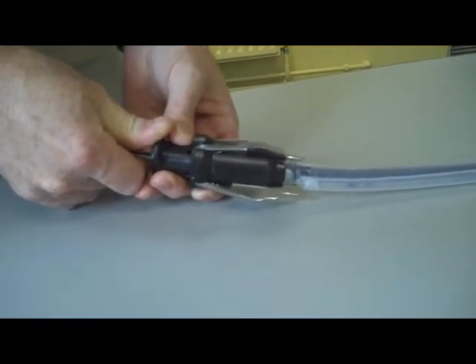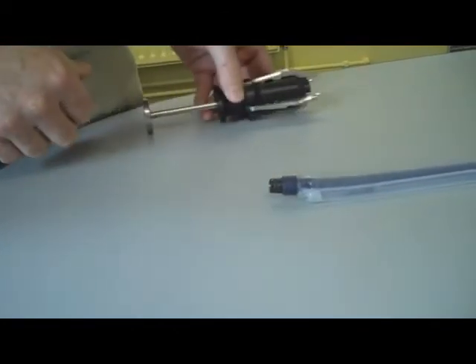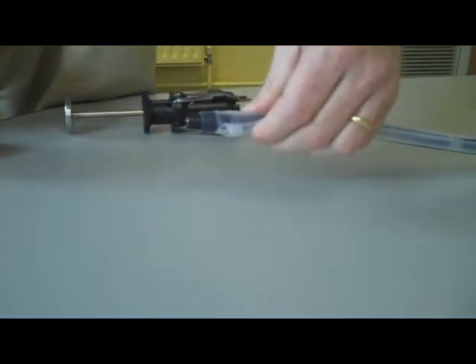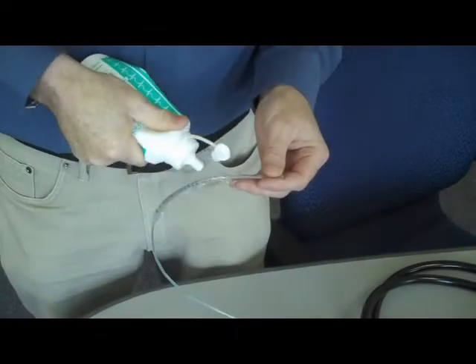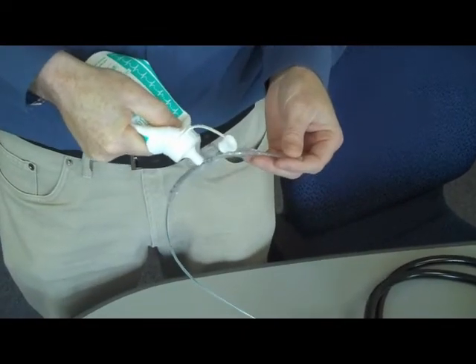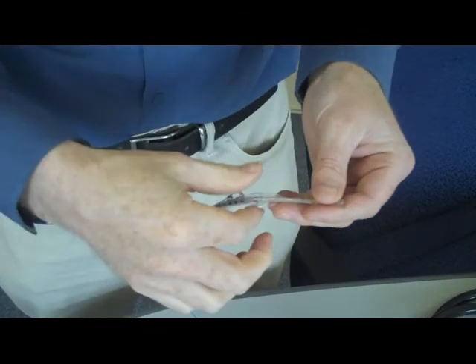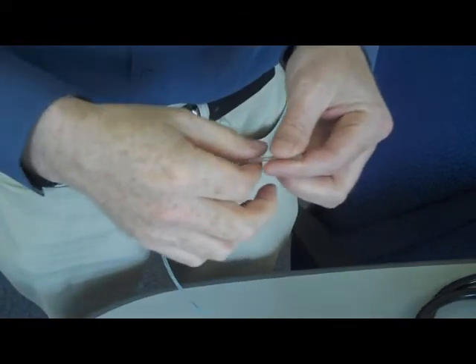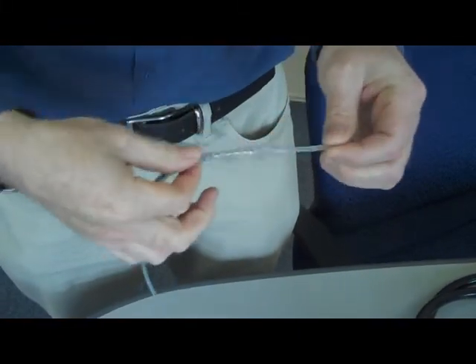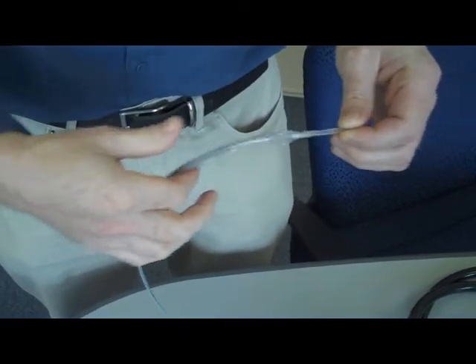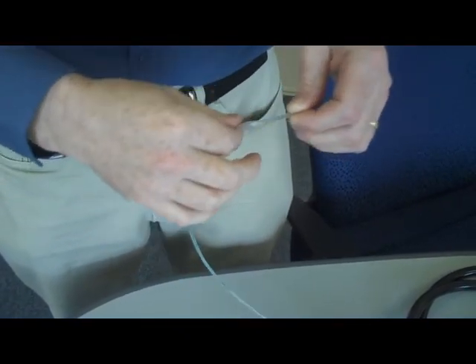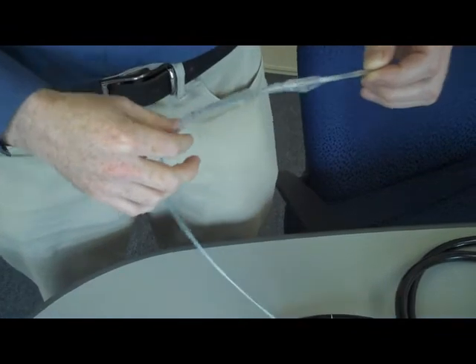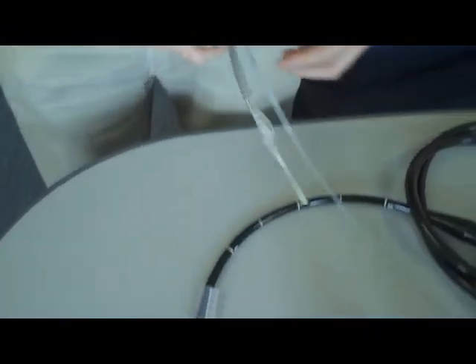Before inserting the catheter, it must be lubricated. To do this, apply lubricant to the catheter and rub in until the catheter balloon and tip are completely covered with lubricant. Once the balloon has been lubricated, it can be inserted.